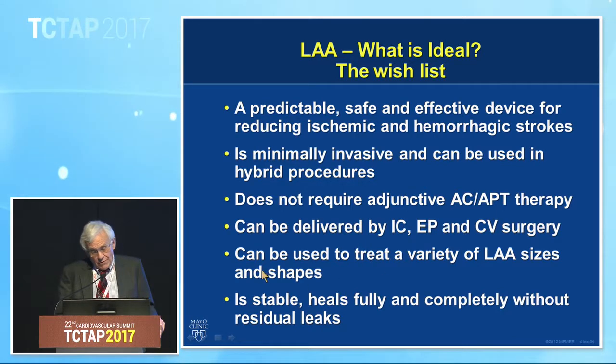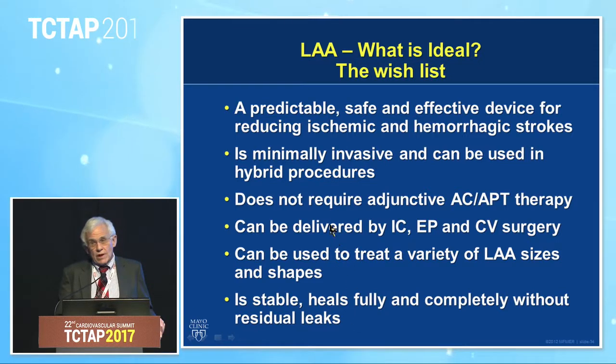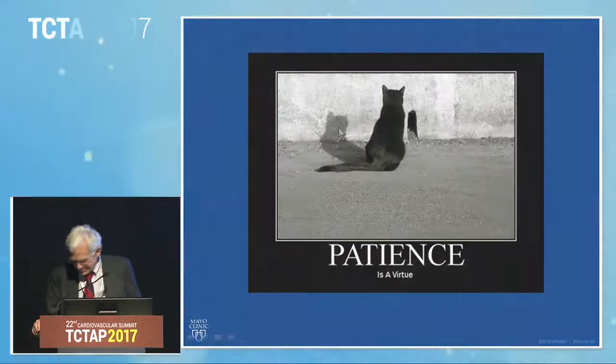It is not perfect, and we want something that is stable, heals fully and completely without any residual leaks. And that is a work in progress. How long is it going to be before we have the ideal device? Patience. Patience. It's coming. Thank you.